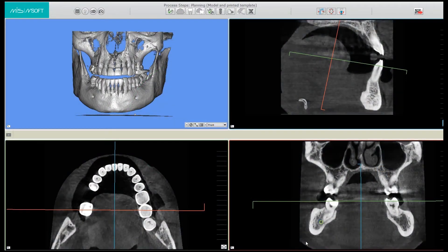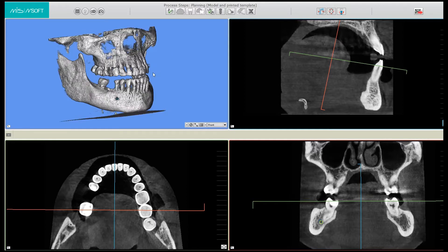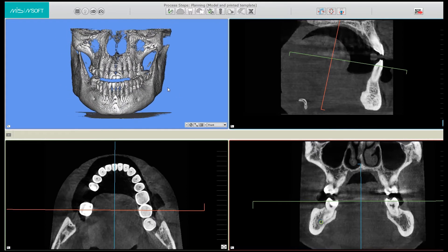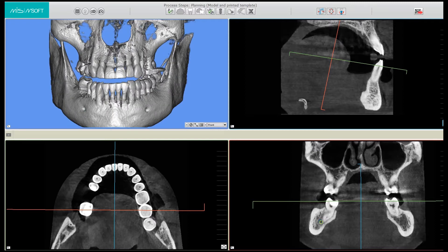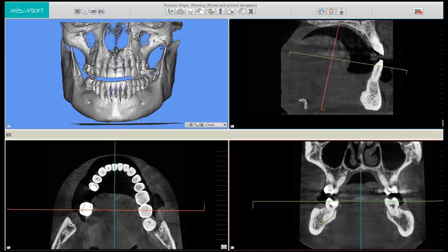This tutorial will take you through an introduction to the matching phase of the planning stage in MSOFT. As you can see, we have a DICOM file. In the 3D view, we can see that this DICOM has an upper and lower jaw. This CT was done according to the MCENTER protocol. The space between the upper and lower jaws is clearly visible, which is specifically requested in the protocol — we'll soon see why the jaws need to be separated.